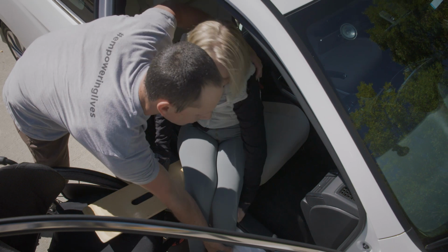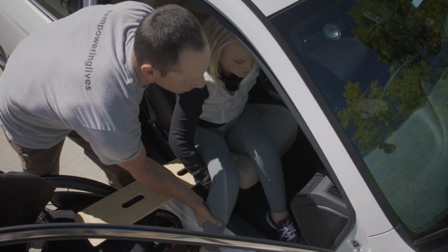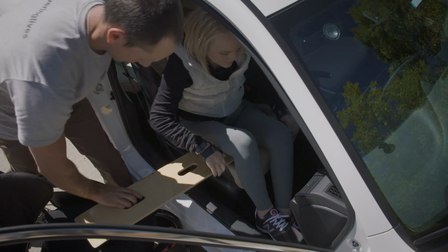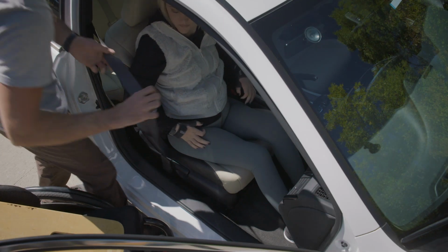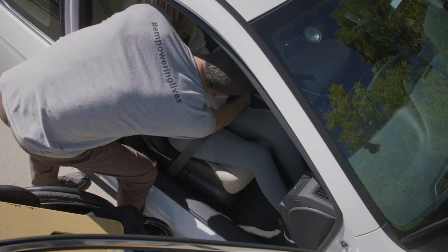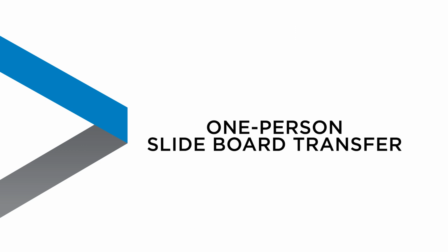Once the hips are inside the vehicle, the passenger can raise their head. Remove the slide board and transfer the legs inside the vehicle. Once you are safely in the car, be sure to fasten the seatbelt. Upon exit, the roles of the assistants are reversed.